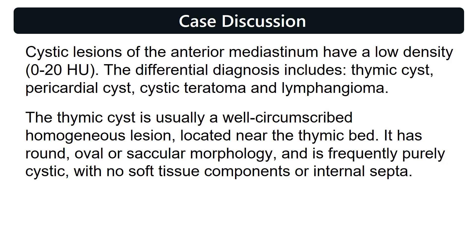Cystic lesions of the anterior mediastinum have a low density. The differential diagnosis includes thymic cyst, pericardial cyst, cystic teratoma, and lymphangioma.